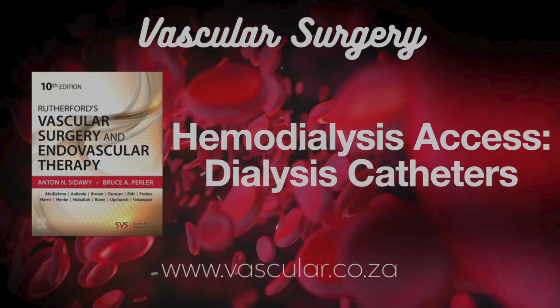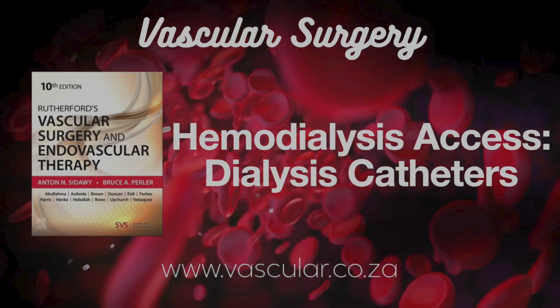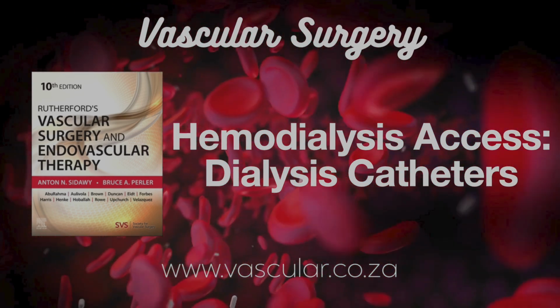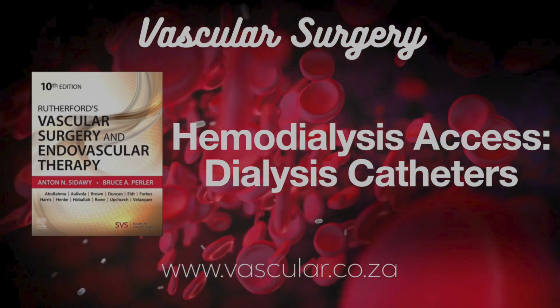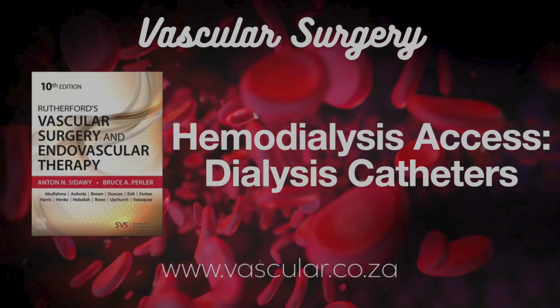Emergency treatment. Absolutely. Remove everything from the catheter lumen immediately. Drain the fluid around the heart, pericardiocentesis, or a surgical window. If it keeps happening, open heart surgery might be needed for repair.